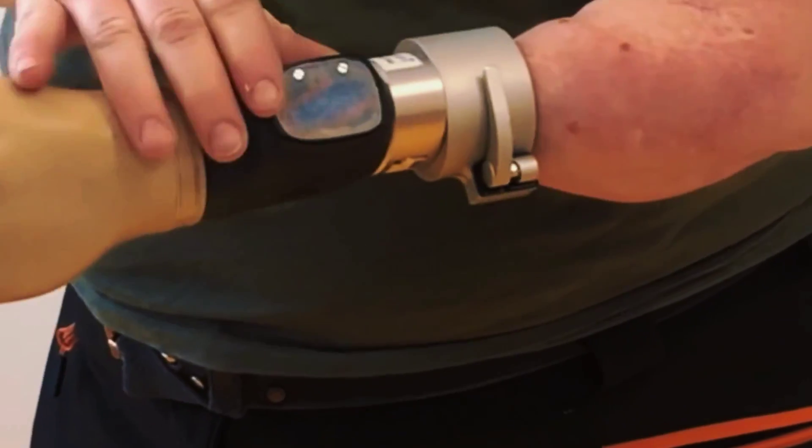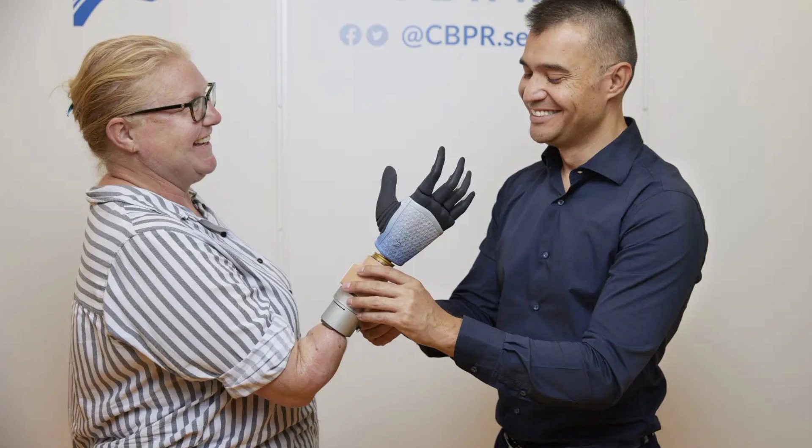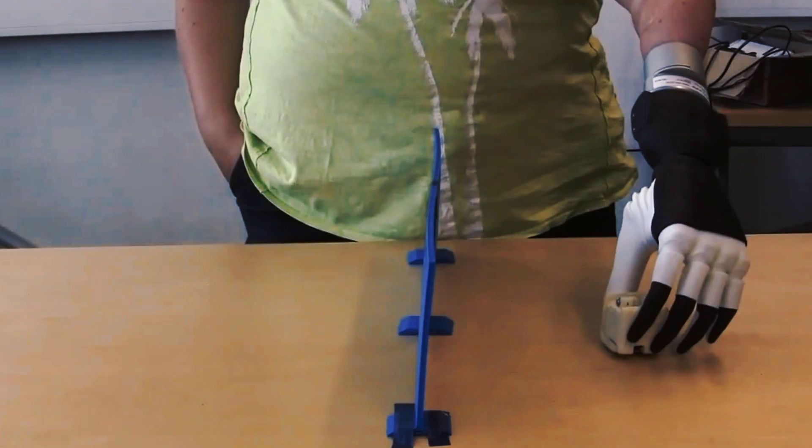They also hope that their results can help other amputees who suffer from limb loss and improve their quality of life. They said, the ultimate goal is to make a more natural way to replace a lost limb.